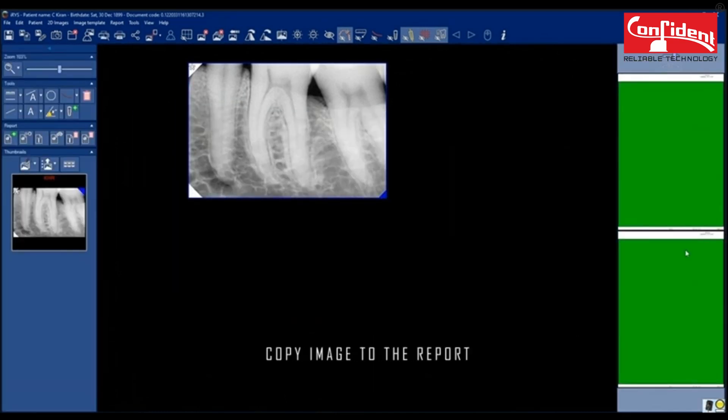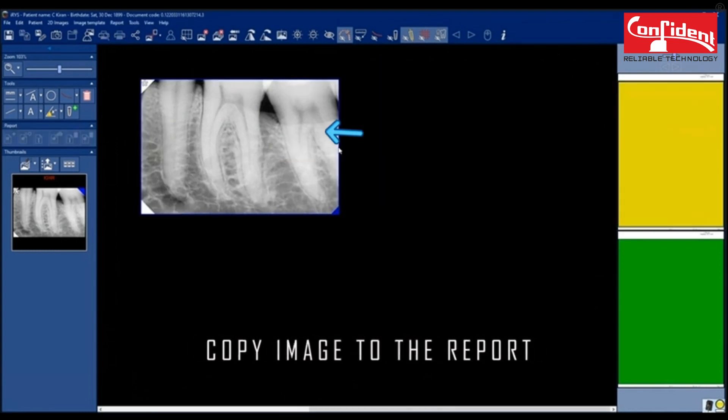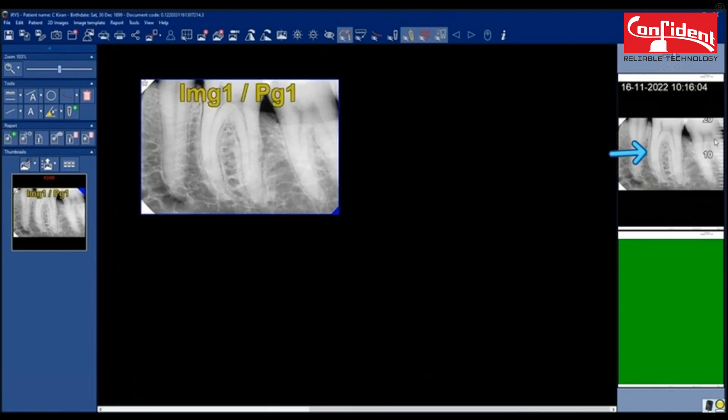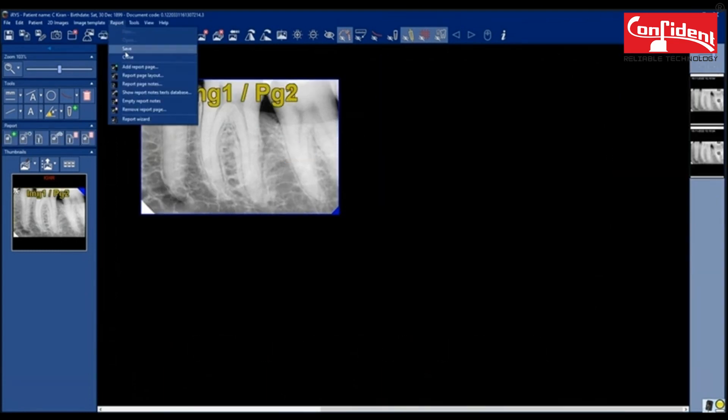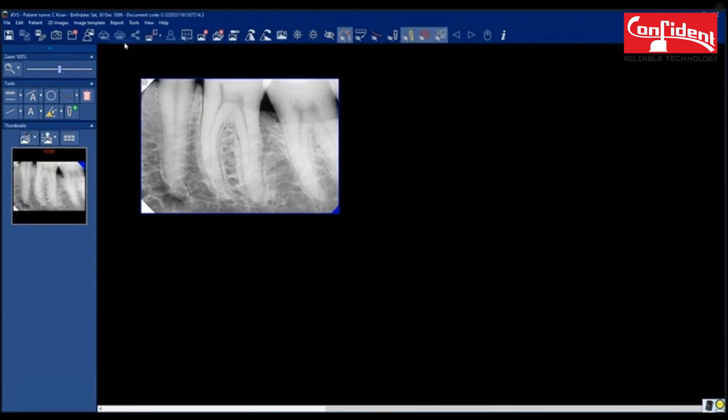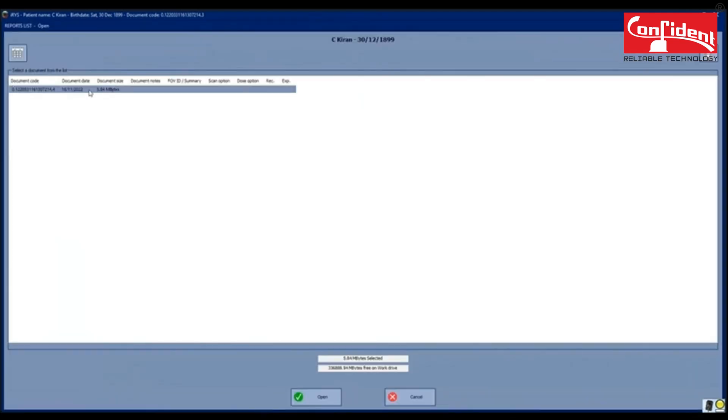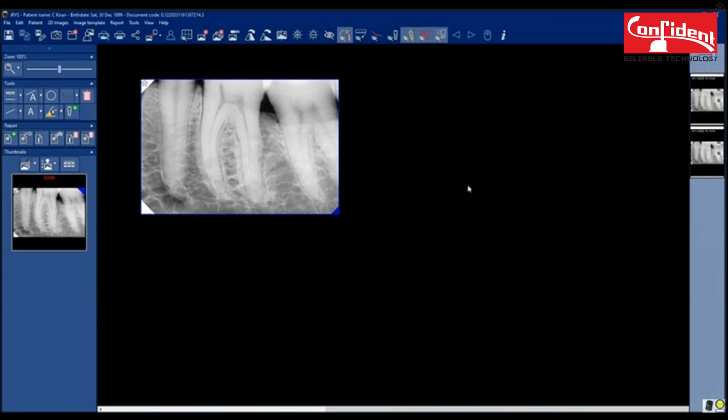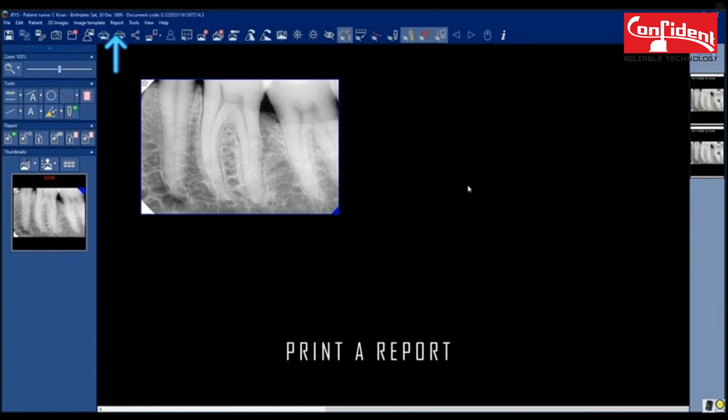To copy the image to the report, click on the image and again on the report window. Save the report. You can open the saved report by clicking on open. Print a report using a printer connected to the system.